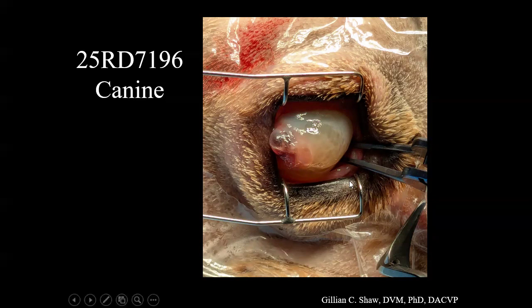So here's the medial canthus. Here's that area of lateral perforation. You can see that the cornea is kind of opaque and maybe looks a little bit expanded and wet. So corneal edema there. This is just prior to the enucleation.